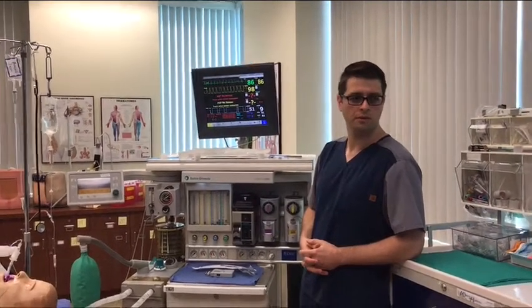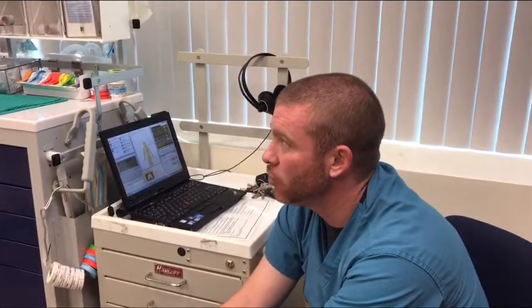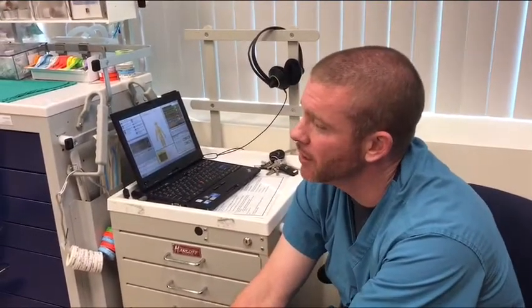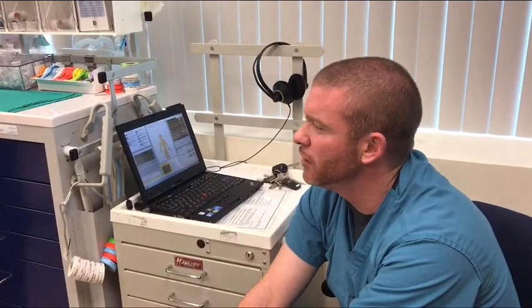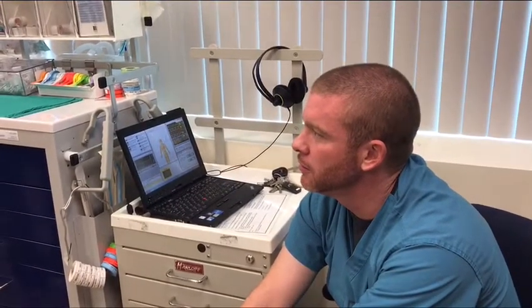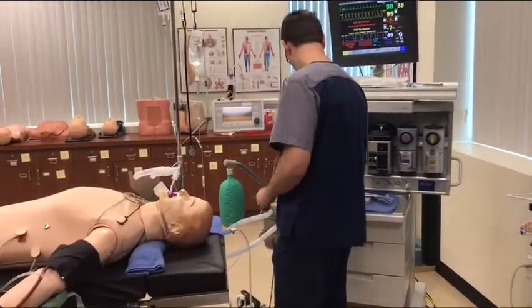Okay, I'll help you. If I think the patient is spontaneously breathing or over-breathing the ventilator, I pull them off of the mechanical ventilator to see if they are. So I would pull them off of the mechanical ventilator. Lower your flow. Go ahead and lower your flows down. There you go. And let's see if he's breathing.